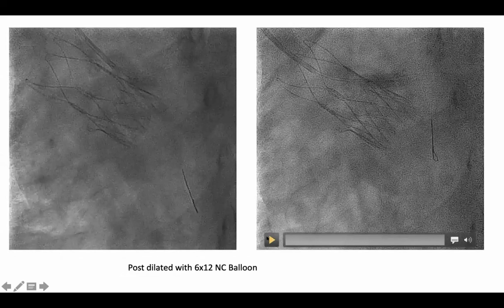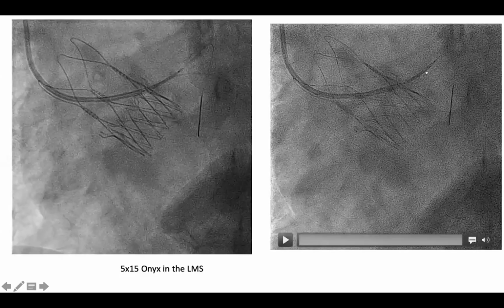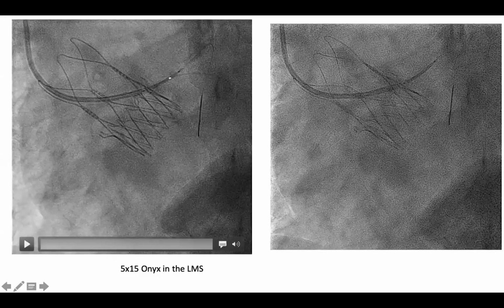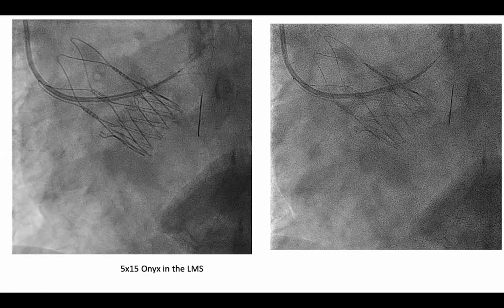So which view was it? Was it the caudal view when you were positioning the stent and deploying it, or which view? Yes, I think we are deploying the stent in the caudal view. Right. No, I think that was the cranial view. Right. Yes, that looks like cranial. But actually, this lady has a very rotated heart, so it wasn't quite working out.